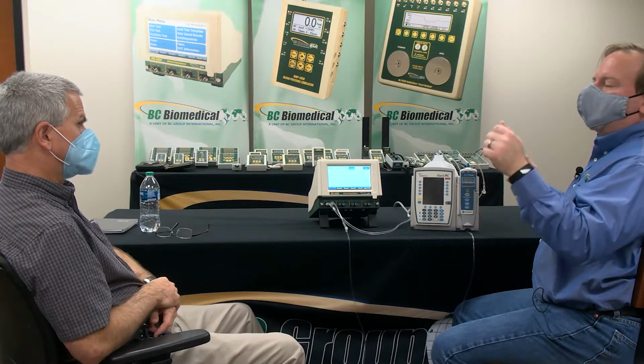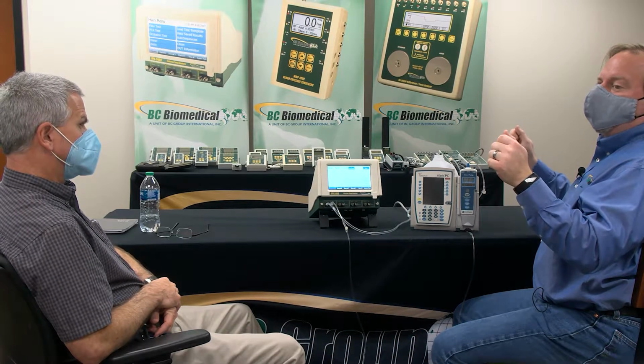Now, that poses the question, if I want to test this pump in a realistic environment. That's not how an IV bag works. So how are you testing your pump? Do you want it to be in true clinical mode, how it's actually being used on a patient? Or do you want it to be in, well, let's keep a continuous pressure on the input so that it can function better?